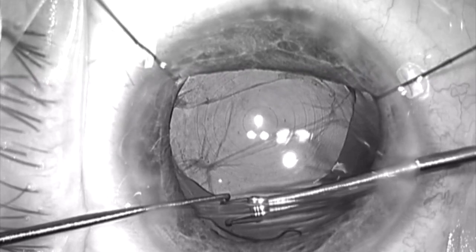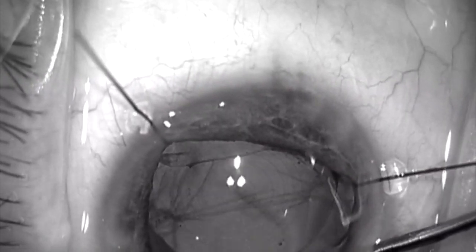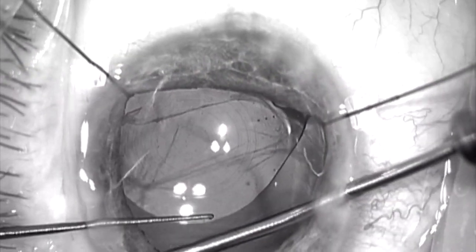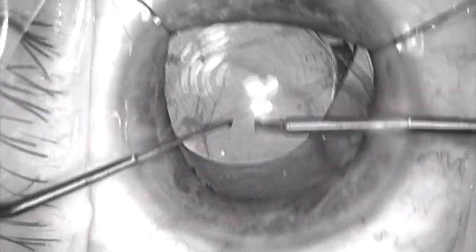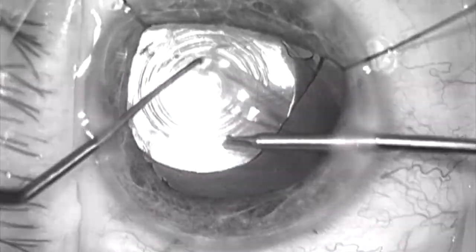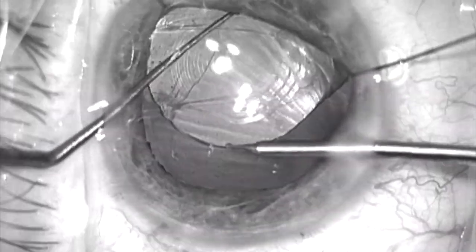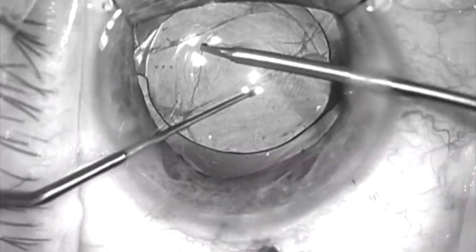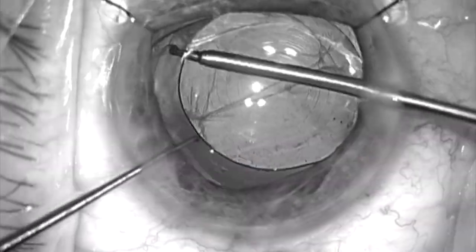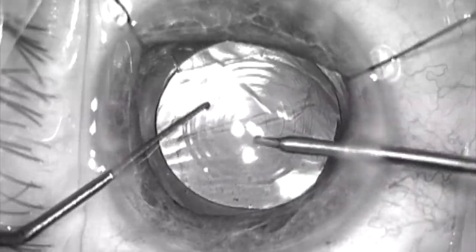Here I'm reseating it. There are some steps that have been edited out, such as removal and replacement of viscoelastic. But here I can feel that the haptic is really totally within the bag. And I'm going to rotate the lens 180 degrees to try to make sure that the haptics break any adhesions between the anterior and posterior capsule as they remain securely under the anterior capsule rim.